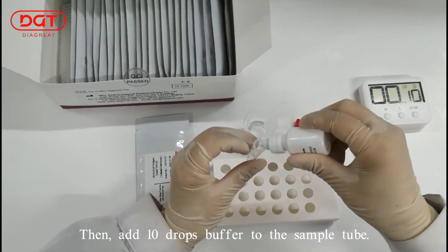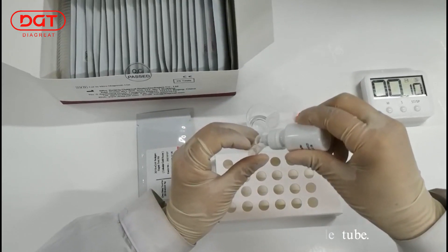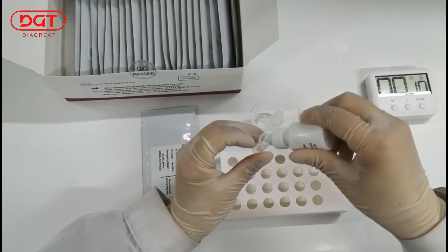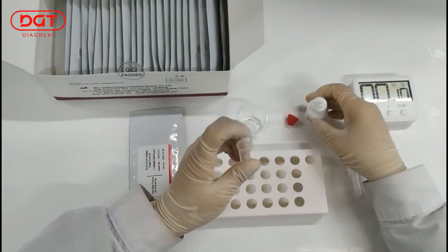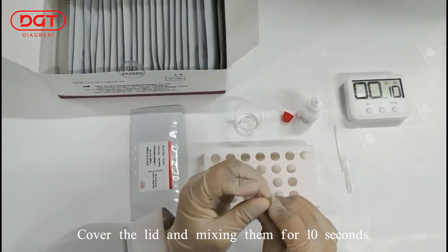Then add 10 drops of buffer to the sample tube. Cover the lid and mix them for 10 seconds.